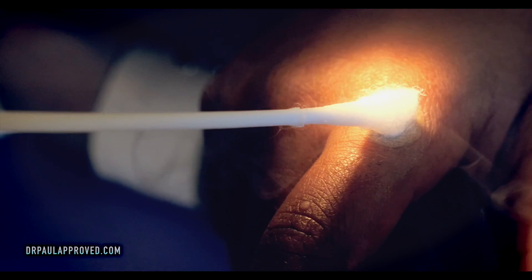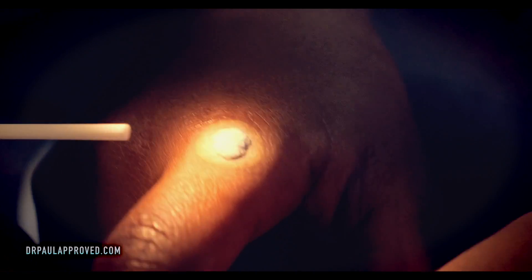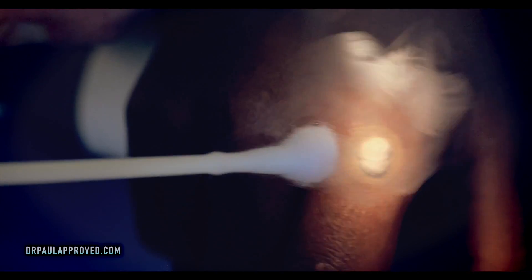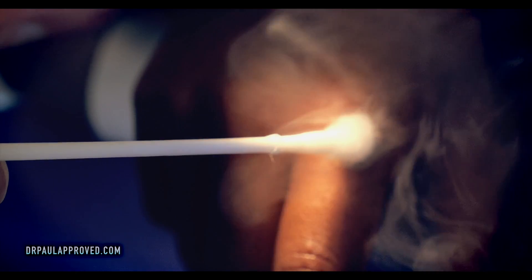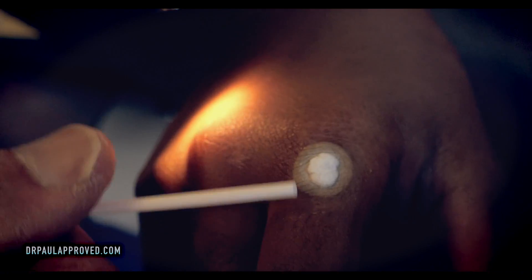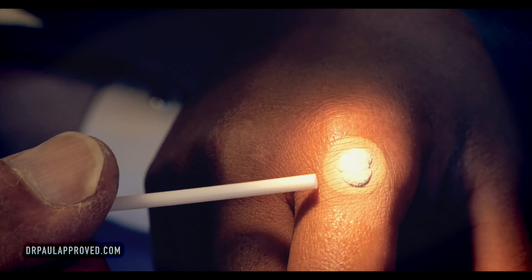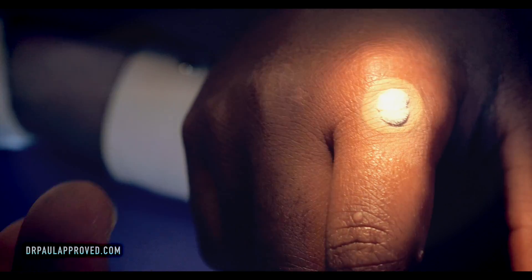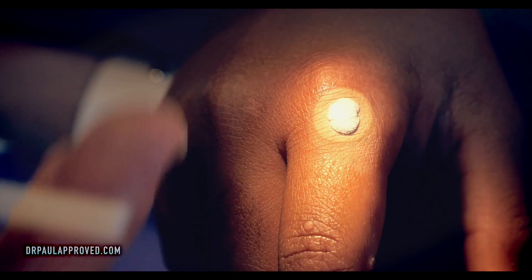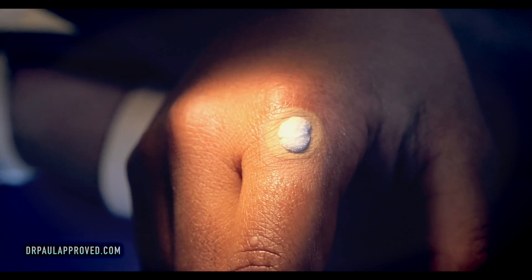So we're almost done here, and you're very brave — I would have been going owie, owie, owie. You see that rim of white? We froze a little bit of your normal skin, which is what we did on purpose. So that way we've got blood flow. When this thaws out, like an ice cube would melt, it'll turn a little red — and that's increased blood flow to the area.